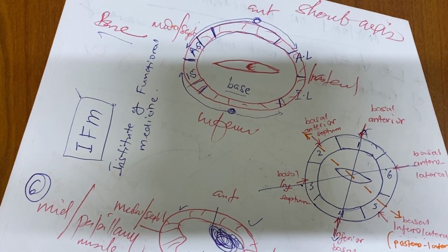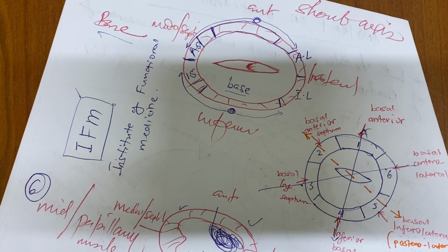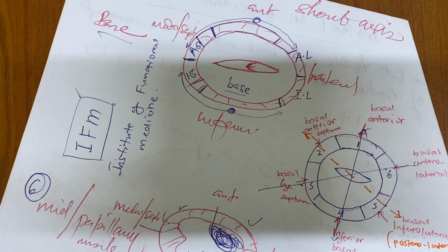seen that when I'm doing it, I first take the short axis, I first take the other view, and then I do whatever I'm doing. I take short axis at all these levels. What you have not drawn is at the level of the valve, because it's not part of this wall segment analysis. And then from there, I go to four chamber.